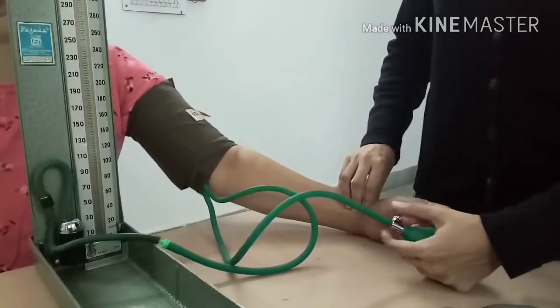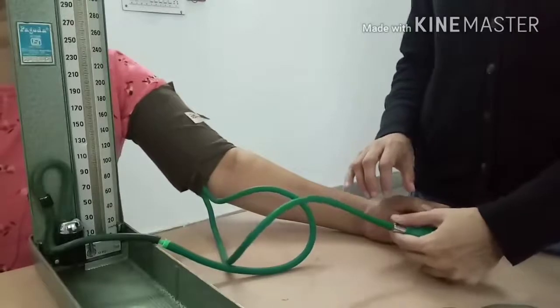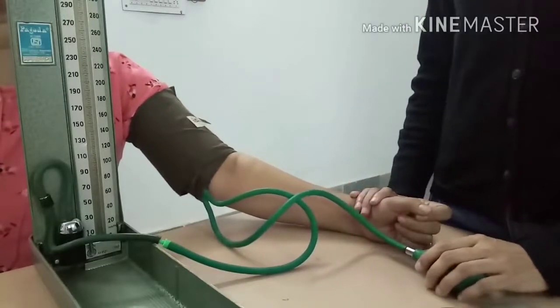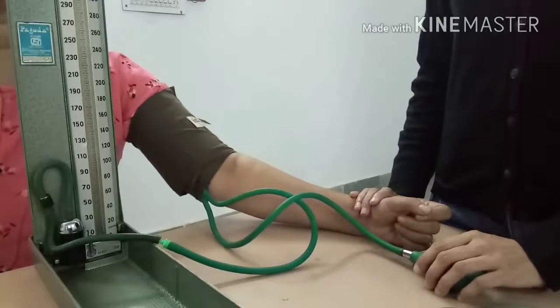Advantage of palpatory method: auscultatory gap, if present, is not missed in the auscultatory method when blood pressure is recorded by palpatory method before auscultatory method.